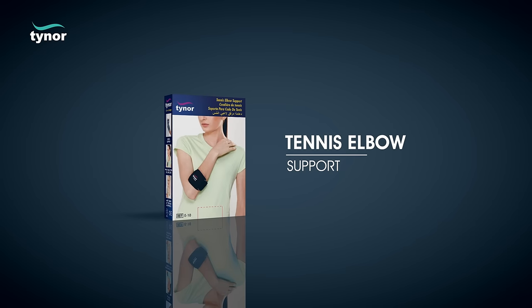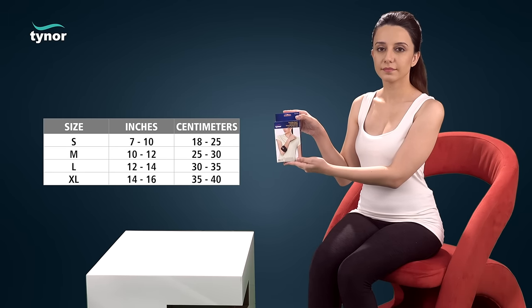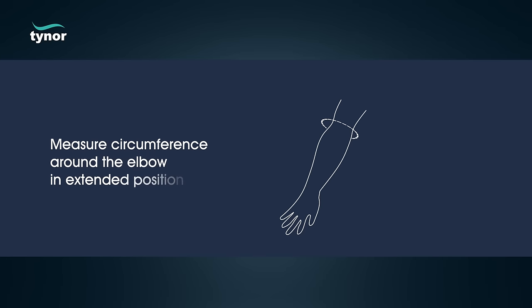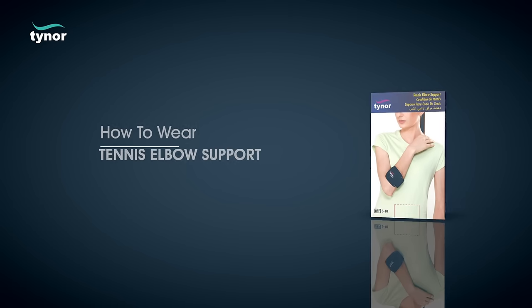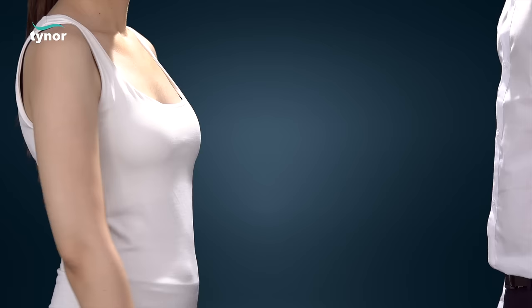Here we will discuss how to use the tennis elbow support. The tennis elbow support is available in these sizes. Measure the circumference around the elbow in the extended position. Now let us see how to wear the tennis elbow support.